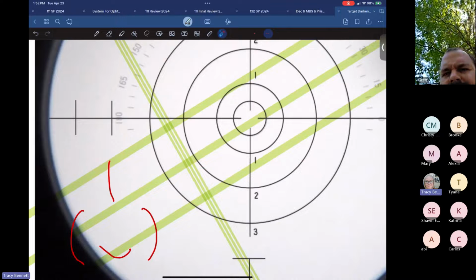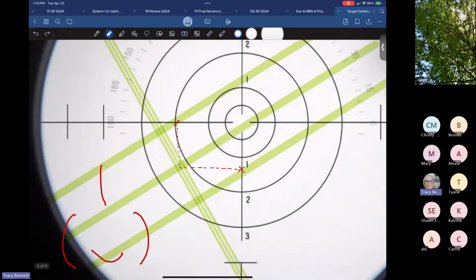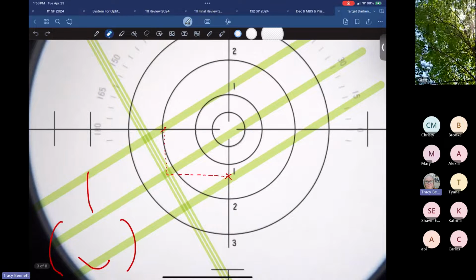What we're essentially doing is with our eyes drawing a line up to here, and with our eyes drawing a line over to here to read those values. And this one is where you get slightly different things, especially when you're in the lensometer actually doing it, because my line right here, like this one, is not perfectly straight.